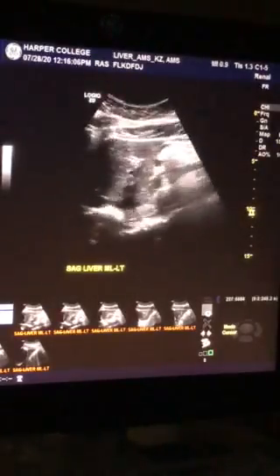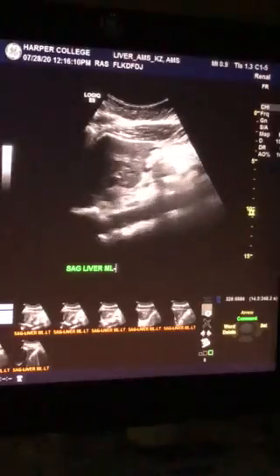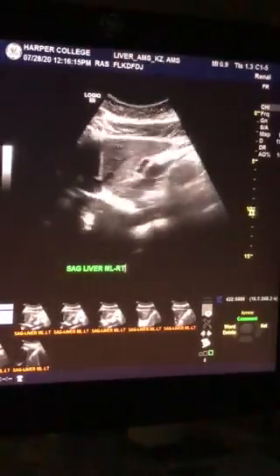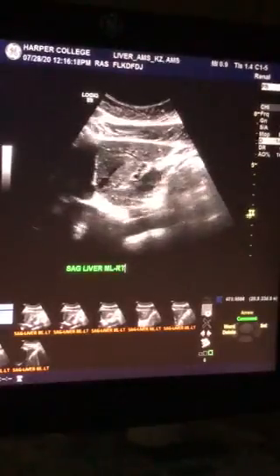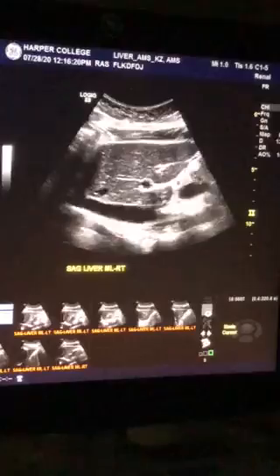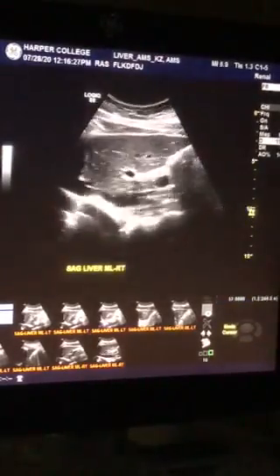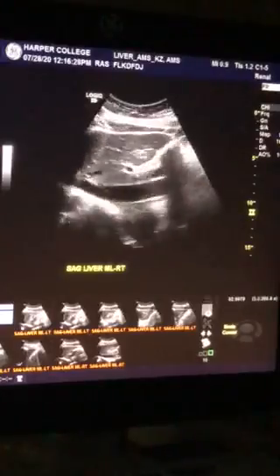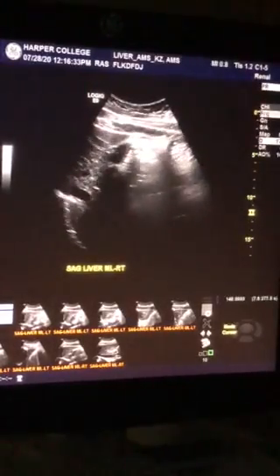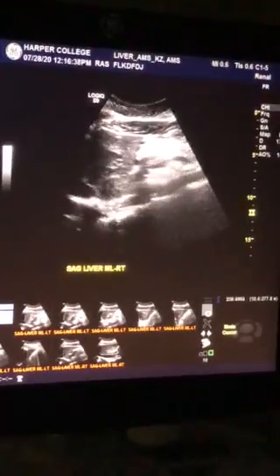So then I'm going to do a long sweep through the right side, the right lobe, and you're going to start at the caudate lobe again. When you're ready, deep breath. The next picture is going to have the IVC in it. You can breathe. For the right lobe and long, I'm going to drop my depth, and I'm also going to drop my frequencies to get rid of some of the shadowing from the portal system. Deep breath in when you're ready.